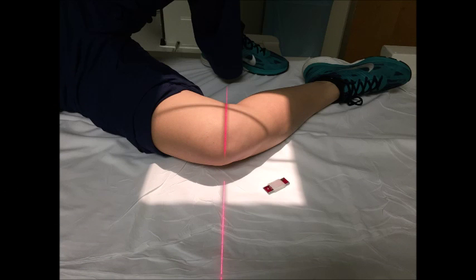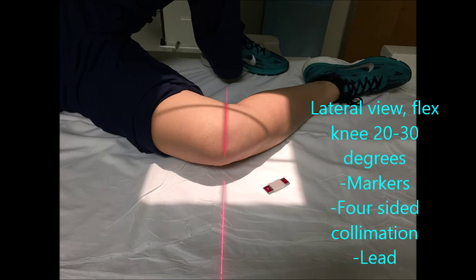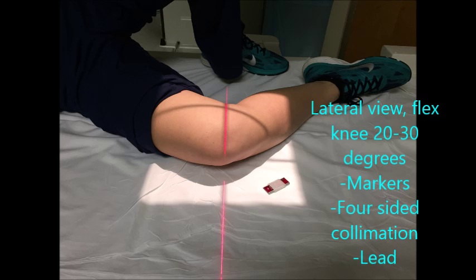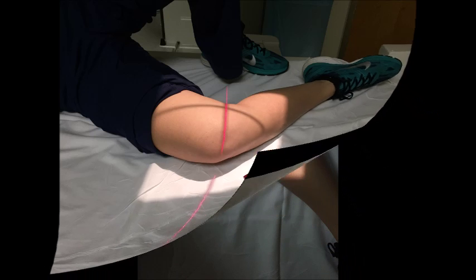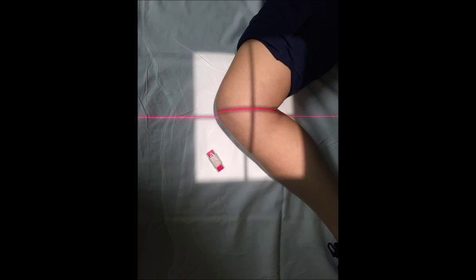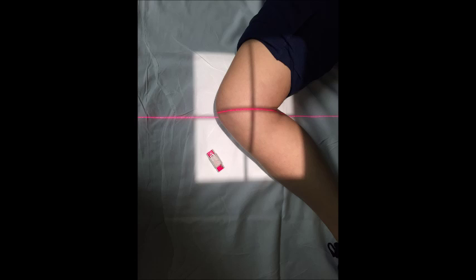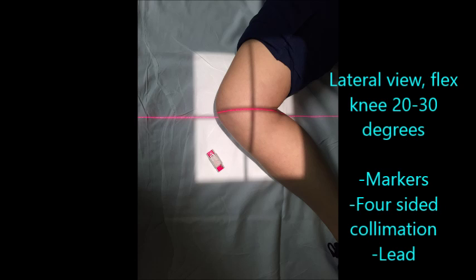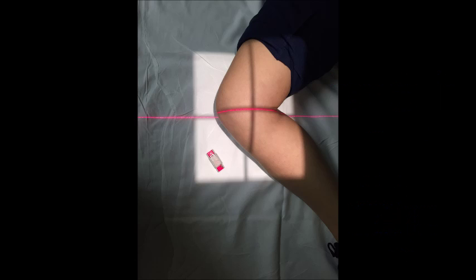For the lateral view, flex the knee 20-30 degrees, with the unaffected leg placed behind to prevent overrotation. Central ray is 5-7 degrees cephalad, centered to 1 inch distal to the medial epicondyle.